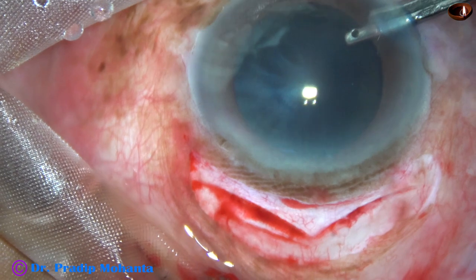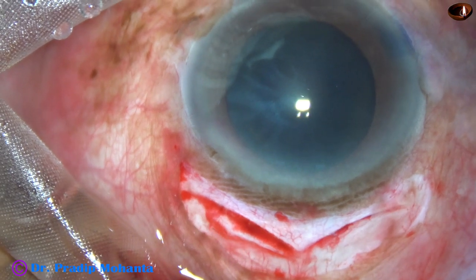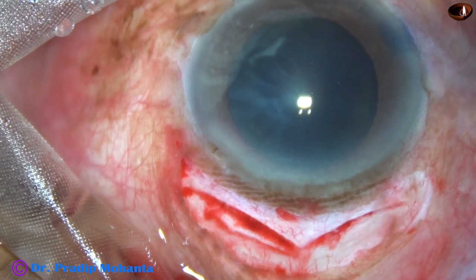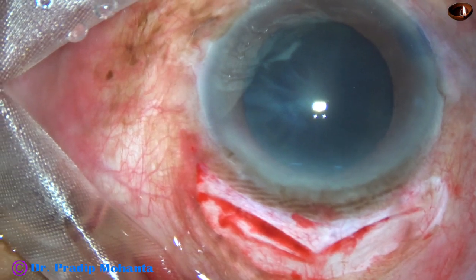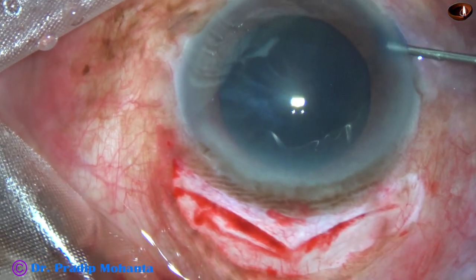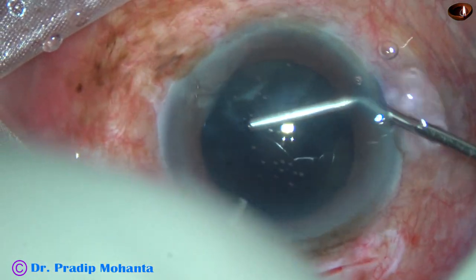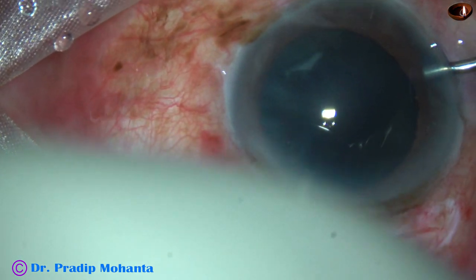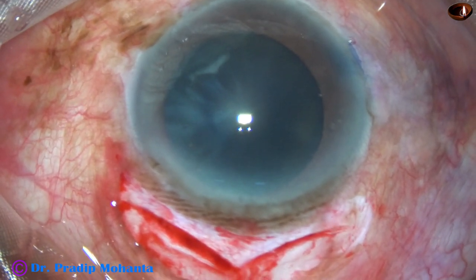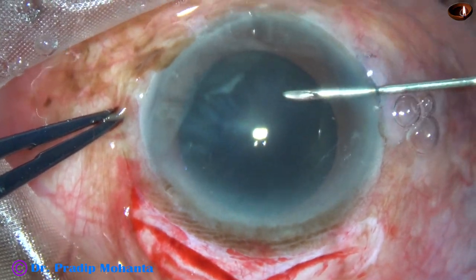Now Visco — 2% hydroxypropyl methylcellulose — is injected into the anterior chamber. Before injecting Visco, I injected adrenalin to see if the pupil dilates a little more. The nucleus is huge in this case.